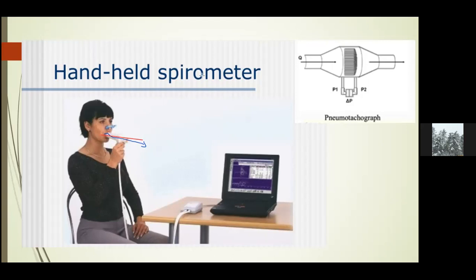Now, if you look at volume and flow, the flow of anything, if you have a cylinder here and you want to check the rate of flow, whether it is water or air, how much volume is passing through here in a given time.